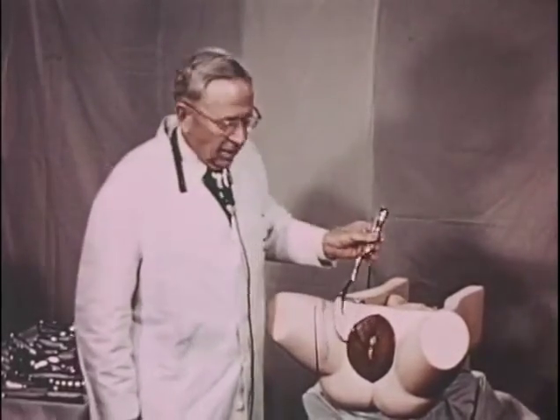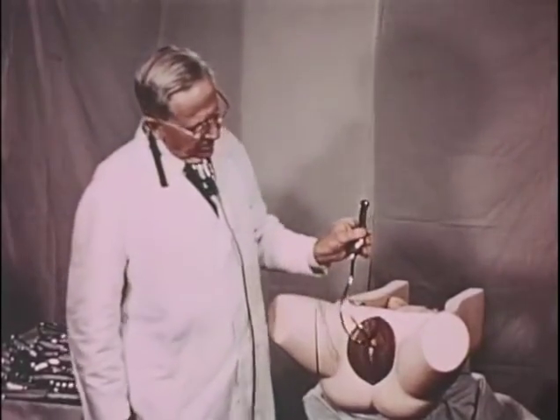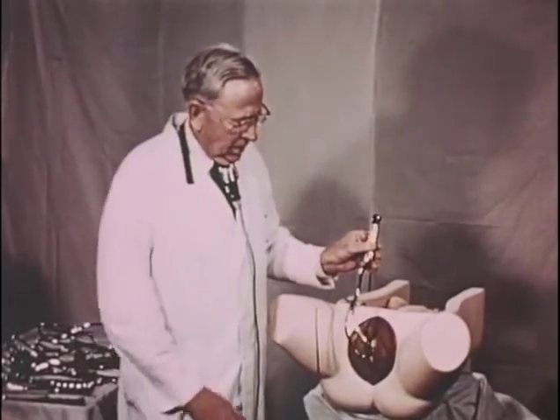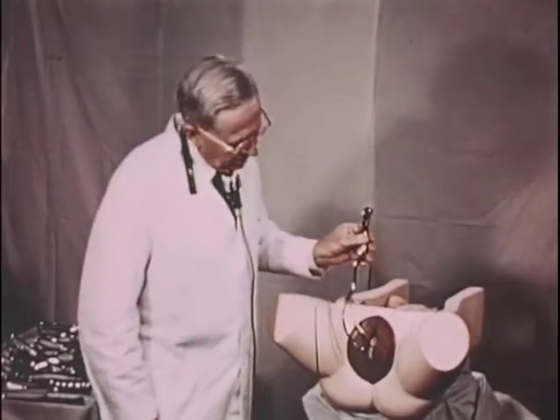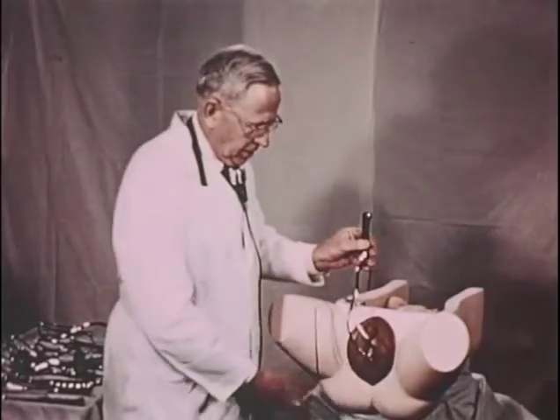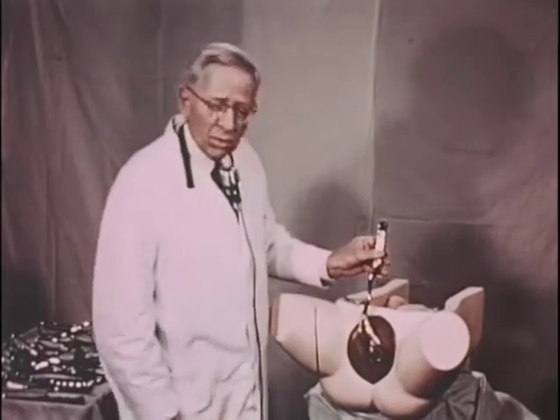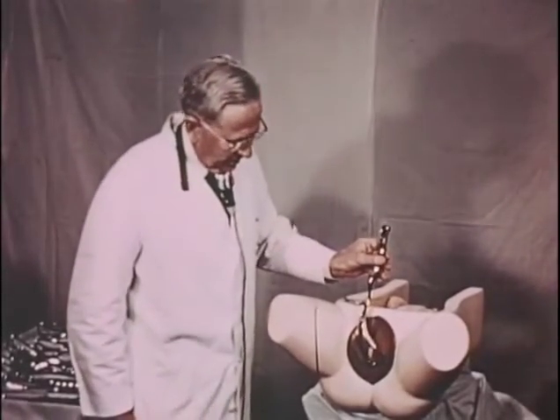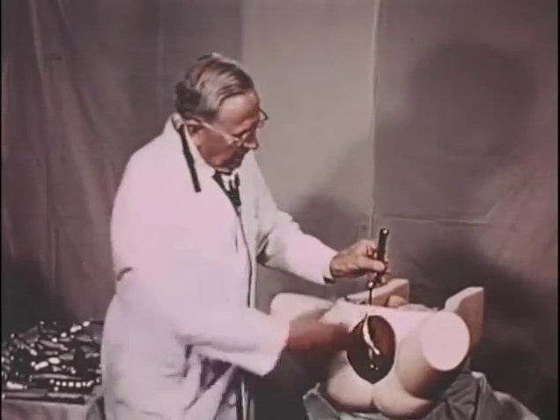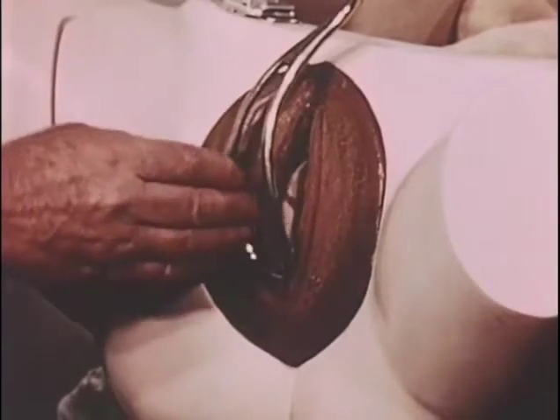The object, of course, is to follow the plane of least resistance. This instrument is held with the toe pointing downward and the convex surface pointed inward, with the shank perpendicular to the horizontal and parallel to the long axis of the patient. Held in other positions, you can see what the difficulties might be. If our shank is not perpendicular to the horizontal, our blade is pointing directly downward and is out of line for the normal cephalopelvic curve.